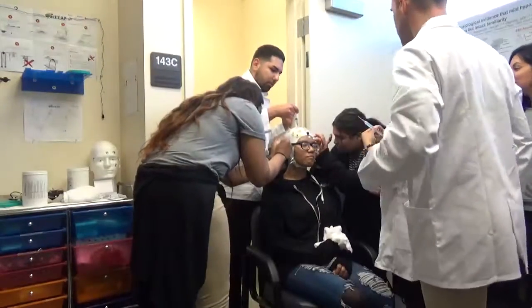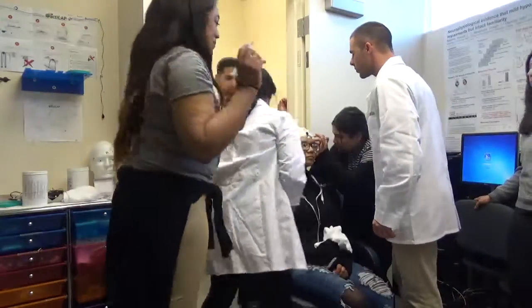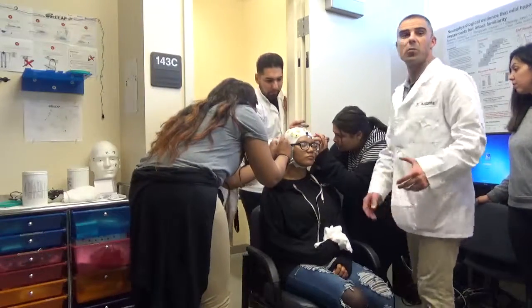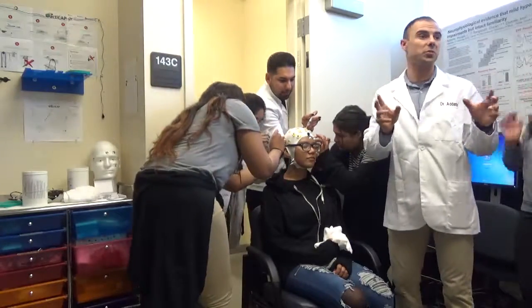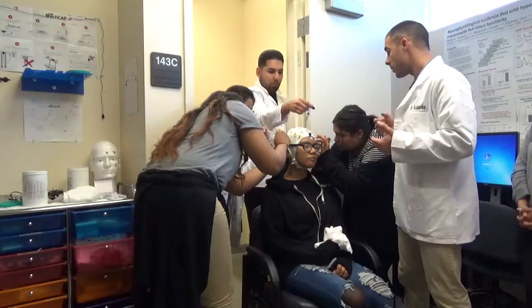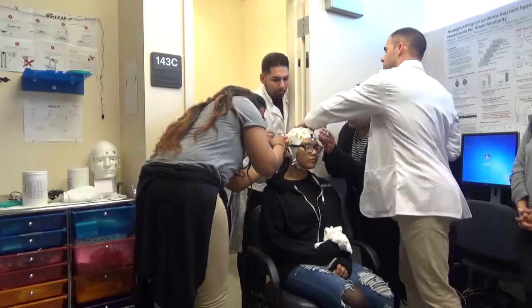So, let me just take a look. I'll go in here. What ends up working, as you work as a team, is you each take a little quadrant of the scalp, which means it goes pretty quick because you each only do about 5 or 6 electrode sites. And so it works out pretty good. So 2 hands. If you can't reach, then don't do it. You shouldn't be doing the front ones, you should be doing this quadrant.